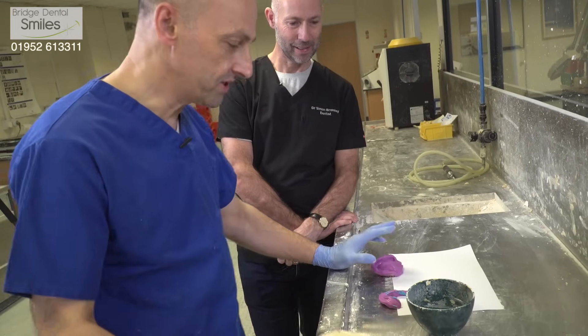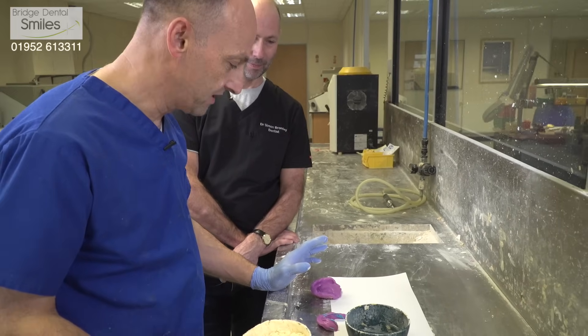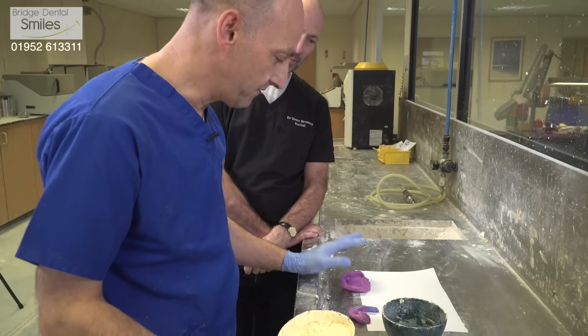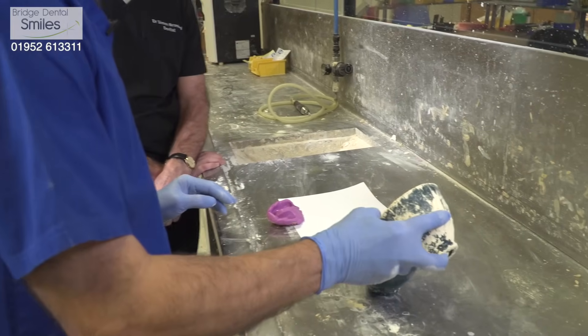Okay, we've had the impressions in from the practice and now we're going to turn these into plaster casts by mixing up the plaster, vibrating them into the impressions and then making up a mound of plaster to produce the model.